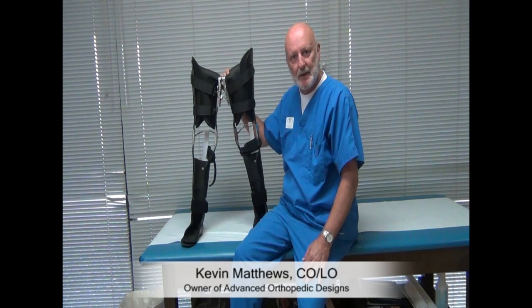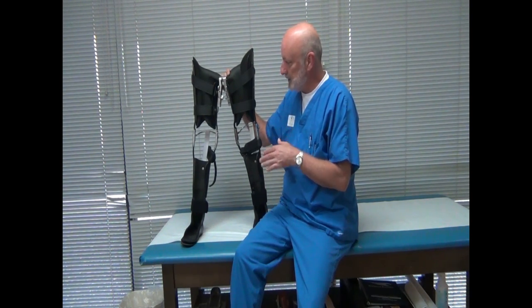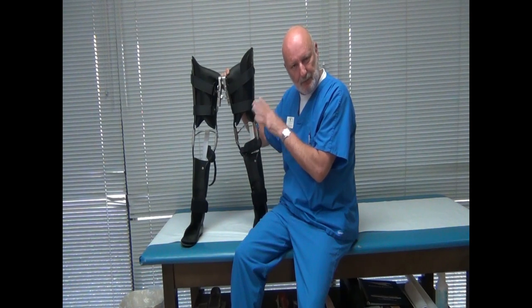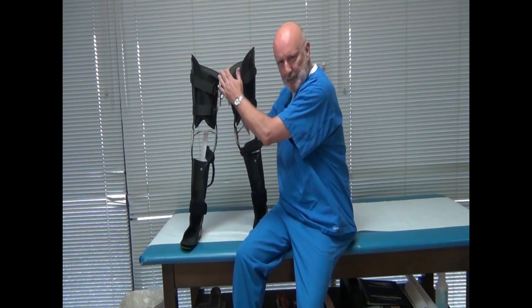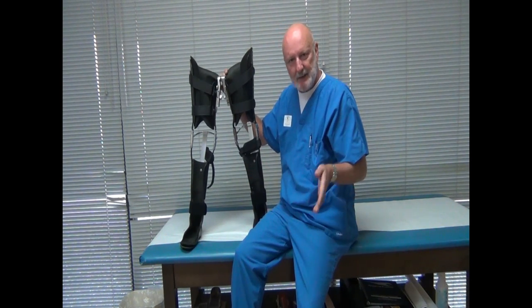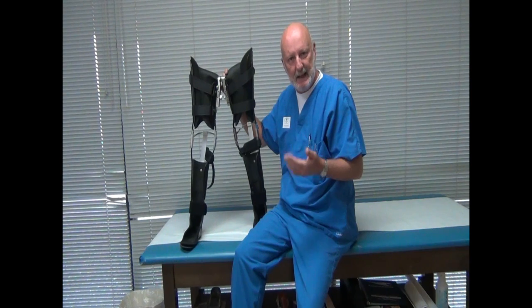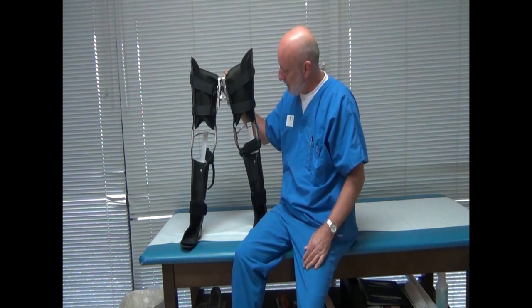Hi, I'm Kevin Matthews, and I'm an orthotist with Advanced Orthopedic Designs. We're getting ready to fit bilateral KFOs, or leg braces, with the Up and About walking fixture that is designed to maintain the legs in proper alignment during ambulation for patients who suffer paraplegia.